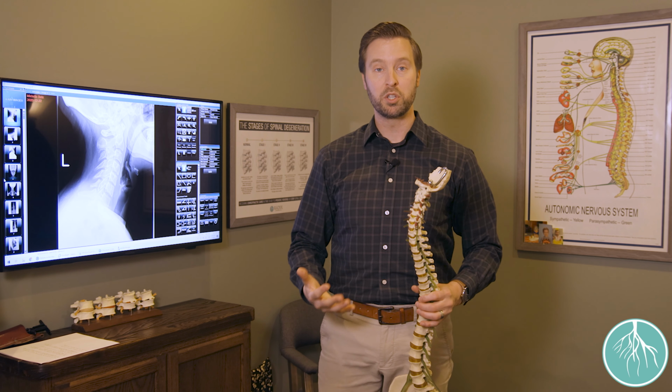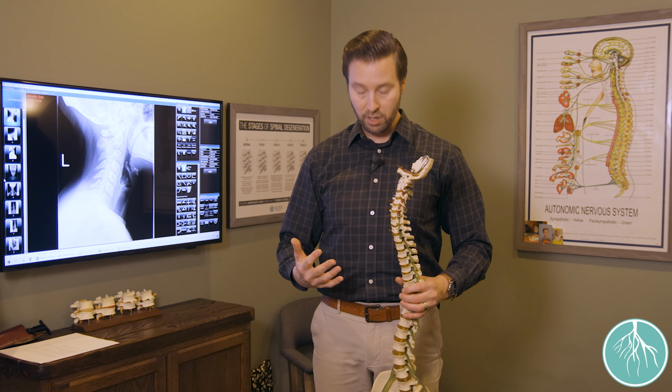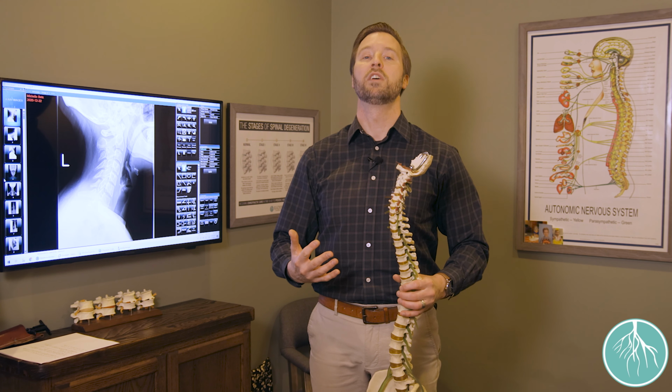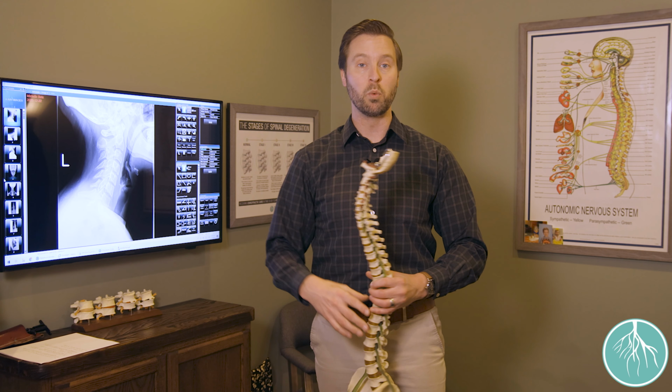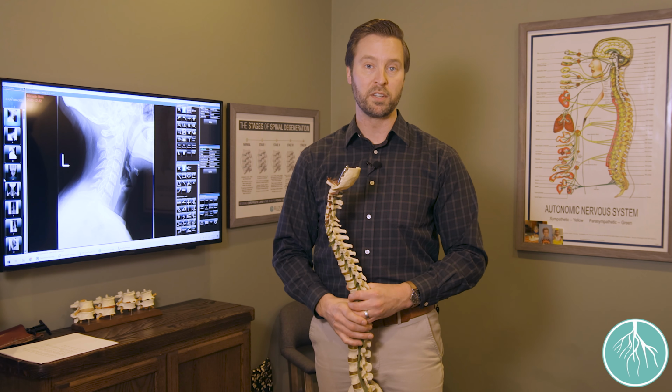We also do motion X-rays, so we do flexion, we do extension, we do side bending views of the lumbar spine. This gives us even more information into how your spine is mechanically moving to see where there's the presence or absence of subluxation.